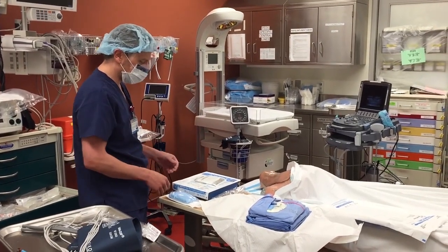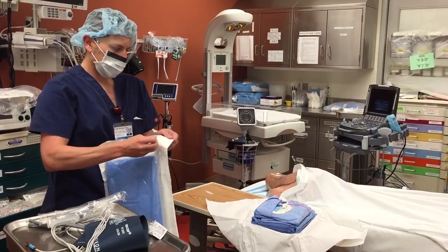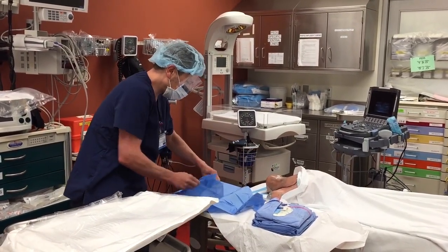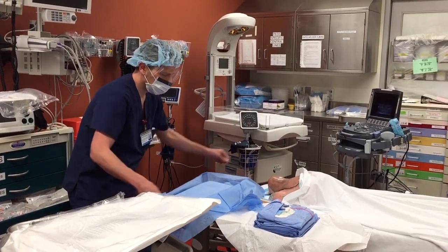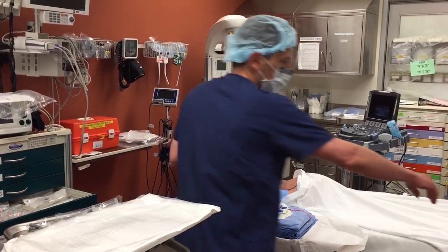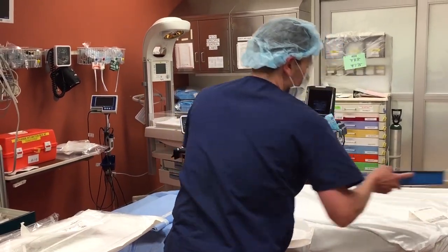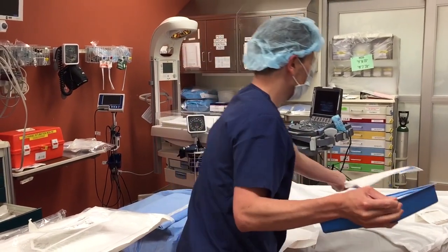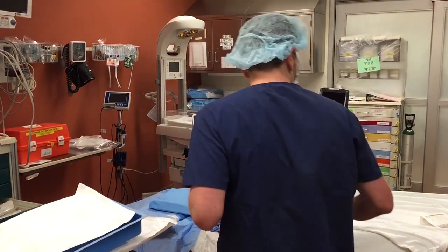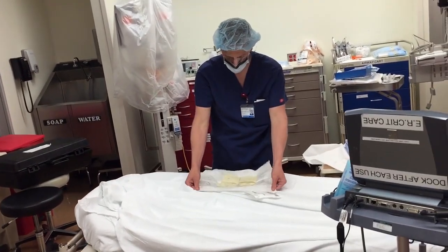While that's drying now, you're going to get the rest of your stuff prepped. What I like to do is use the LAP drape packaging as my actual sterile site. So there's my drape, and now I'm going to open my probe cover and my central line. Open your gloves somewhere flat where you're not going to have them fall onto the floor.